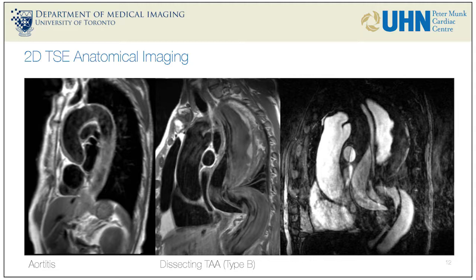On the center slide, you see the same technique applied in a patient with a dissecting aneurysm of the descending thoracic aorta, and just shows you how complex the contrast mechanism may actually be. This is the sagittal, this is the axial image. I'm just going to overlay the one with the contrast-enhanced MR angiography, and you see this part here is still slow-flowing blood, while the rest is different signal intensities in a complex thrombus of the aortic wall. We not necessarily use that for a lot of information. This is something that may be of interest in case you have a patient coming in for, let's say, acute chest pain, acute aortic diseases, when it's about penetrating aortic ulcers, potential intramural hematomas, a population we rarely see in MR. In our hospital, those patients are predominantly going into CT and CT follow-ups as well.